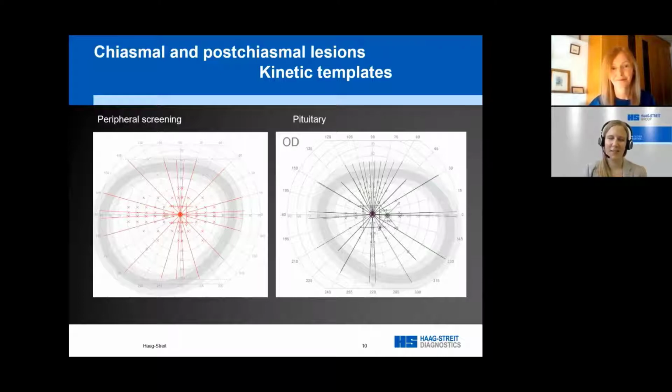Have you seen an increase in standardization across different technicians in your clinic using these templates? For us, yeah. And bear in mind, most of what I do links into research, usually in some way, shape, or form. And you really do need some introduction of standardization if you're going to do tests and certain strategies repeatedly from visit to visit, as well as with different clinicians. So we definitely have far more confidence from using those templates as a guide. And I mean, that's important for clinical practice as well.